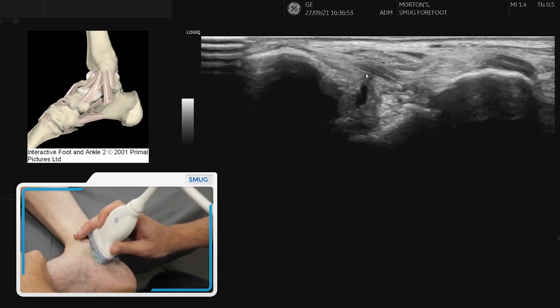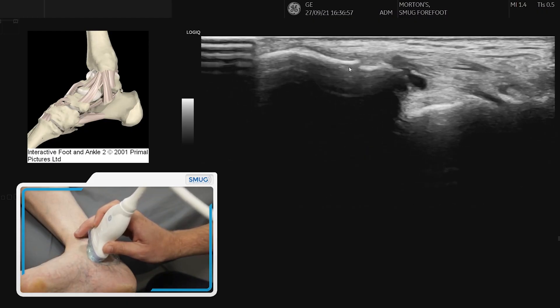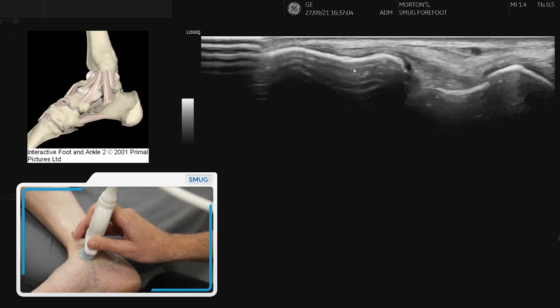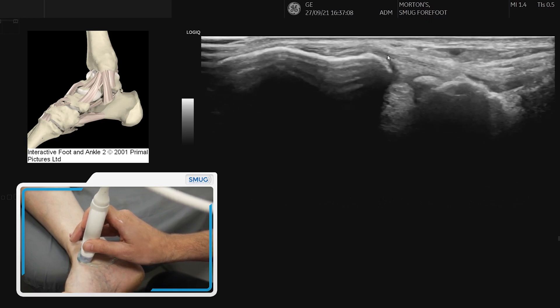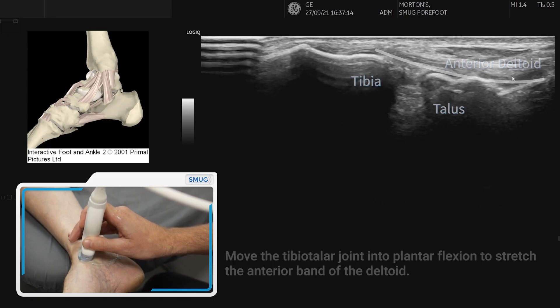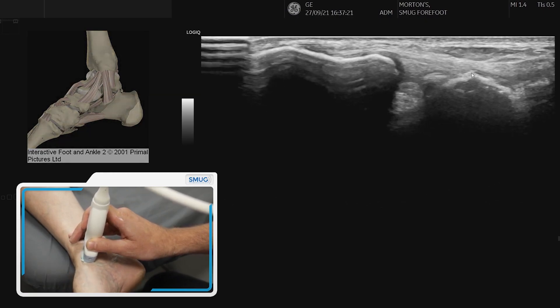Fishtailing around the distal end of the probe while keeping the tibia in view, we should be able to find another band — the more anterior band — which we can see attaching from the tibia. Using a little bit of plantarflexion you can see the band going from the tibia onto the talus. There are also some attachments onto the navicular, but here we can see the anterior band coming down, and with a bit of plantarflexion we can stretch it.